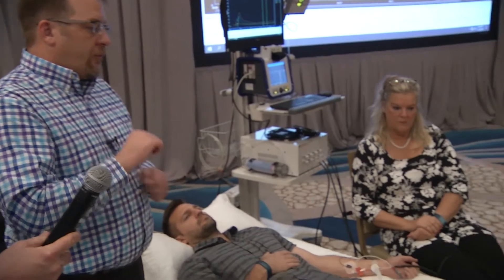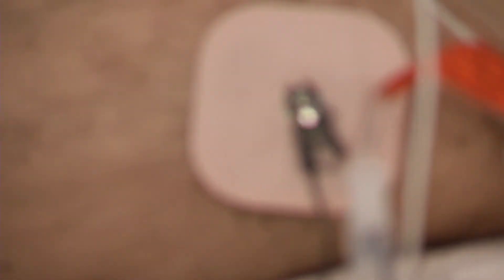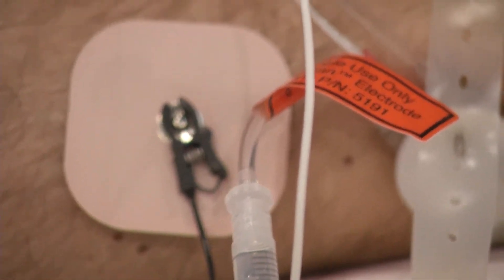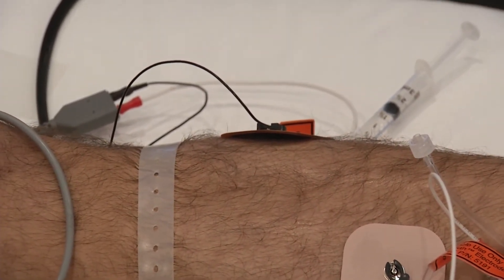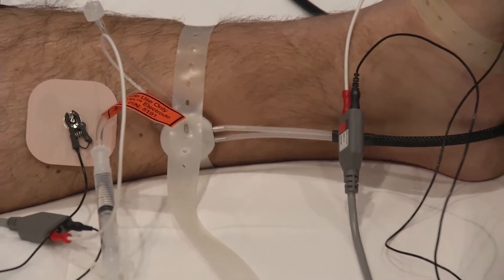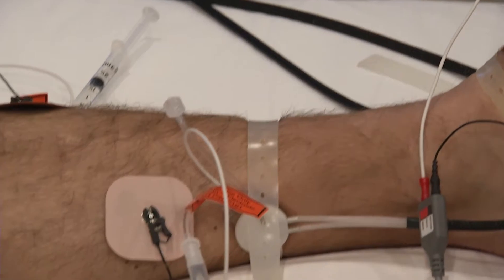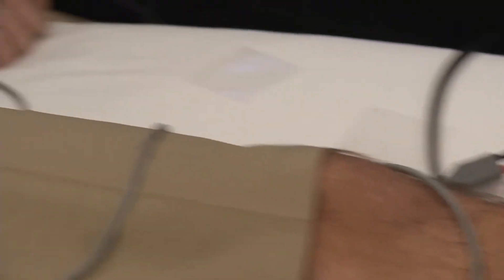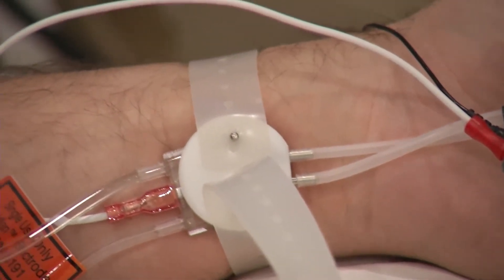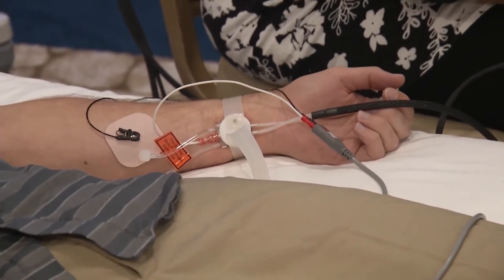Tony mentioned the down-and-around technique for placing capsules: we go around the bottom of the limb first and then attach to the top side, so the bottom makes a really tight seal against the skin. We found this helps prevent most leaks at the foot. It also means if you need to tighten a particular area you can pull from the top rather than the bottom. These are tips and tricks we found to help reduce errors and pitfalls of the testing.